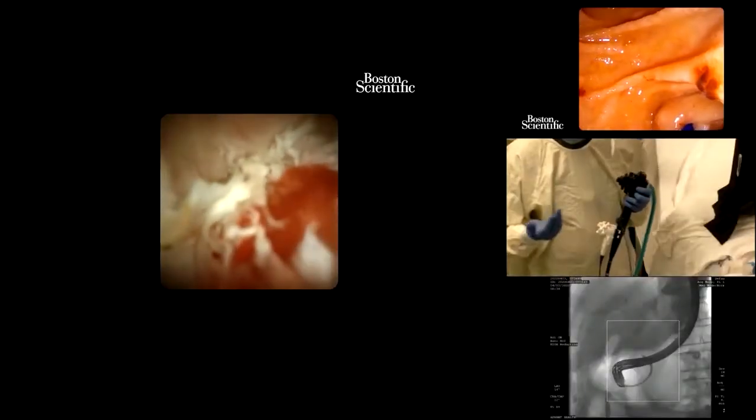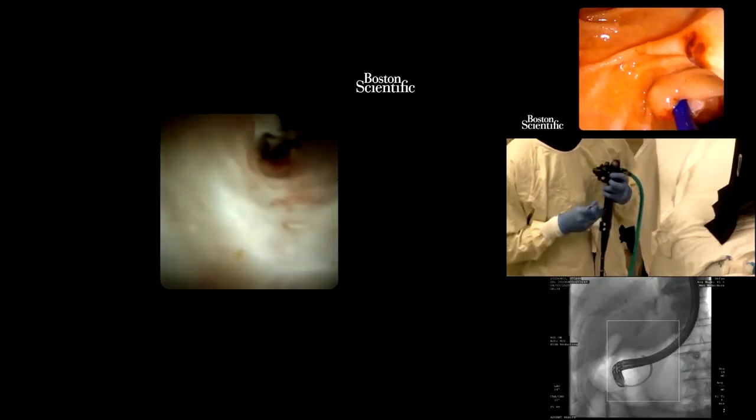So, gee, this is pretty efficient. When you were talking, we already finished our third pass. Oh, excellent. In clinical practice, we usually perform only three biopsies with a sensitivity of 90%, but that all depends on how the ROSE looks. So let us see how our on-site evaluation of the specimen looks.